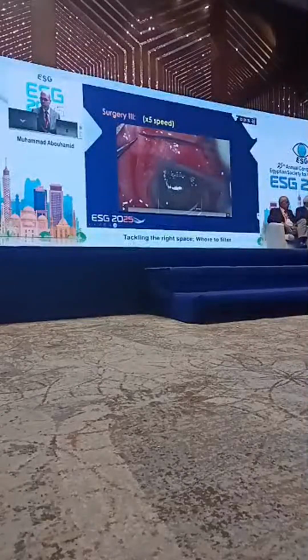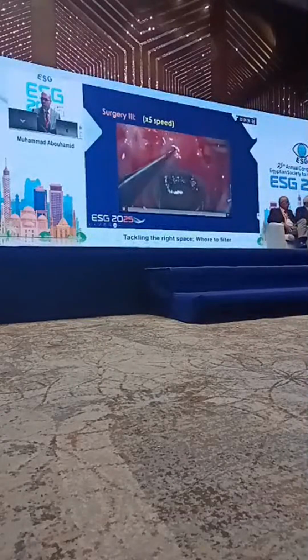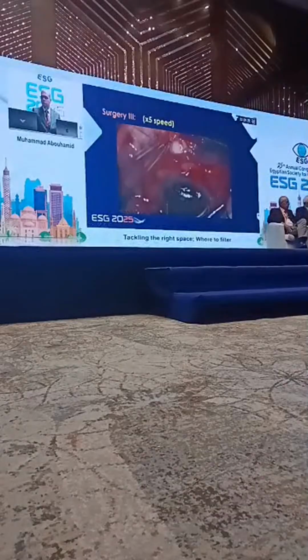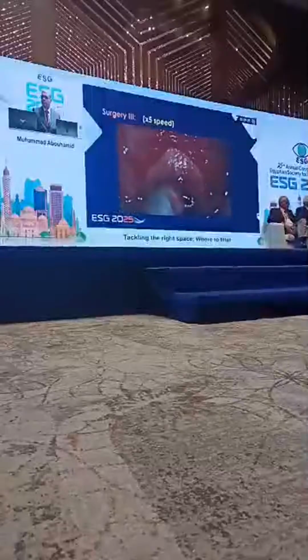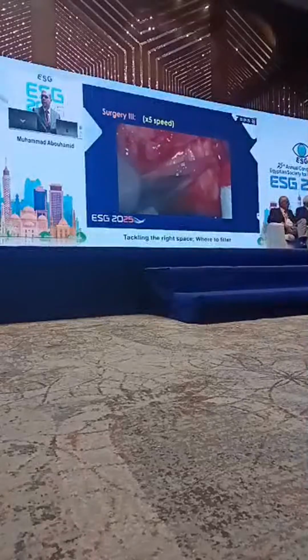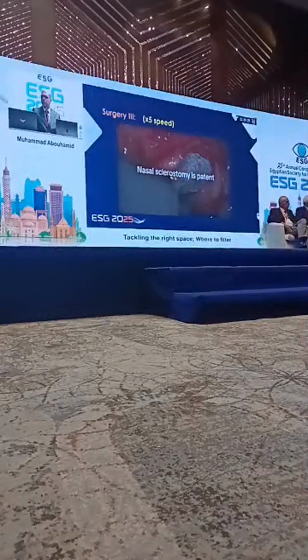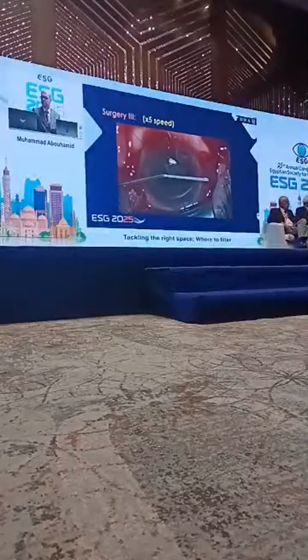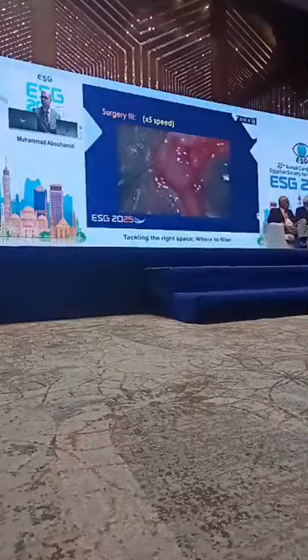This is a very short clip of this surgery. Apologies for being slightly off-center. First, we revisited the parasclerostomies, and the nasal sclerostomy seems to be intact and open. To create more drainage, we reformed the anterior chamber with viscoelastic and addressed the temporal sclerostomy again. But sorry, it's not well shown here in the video.